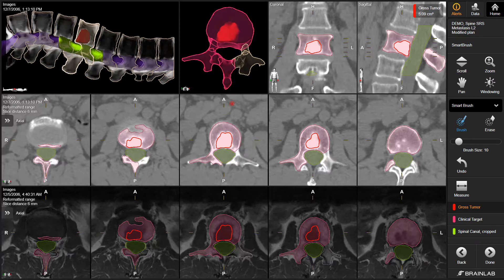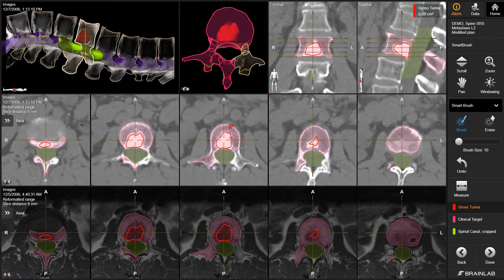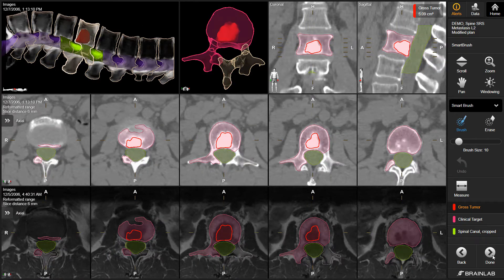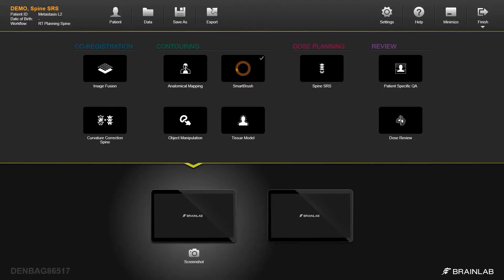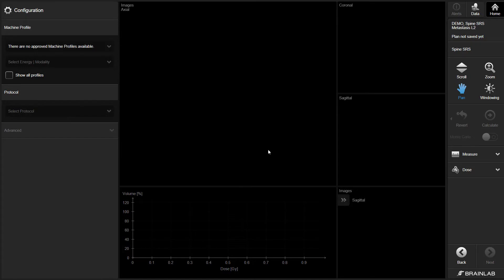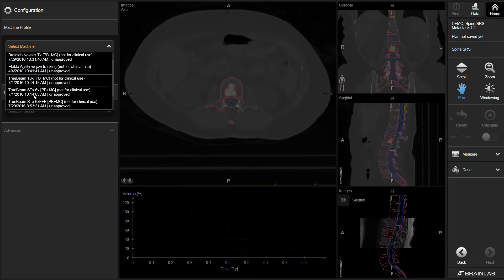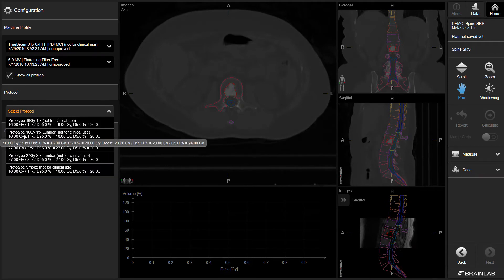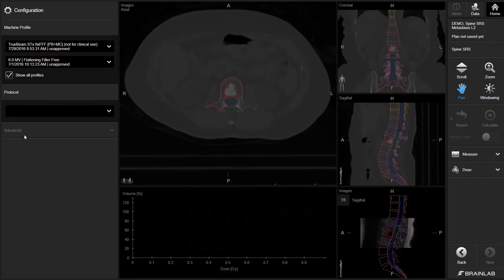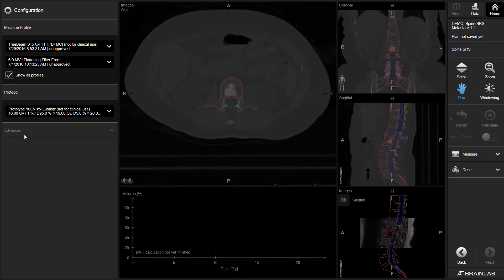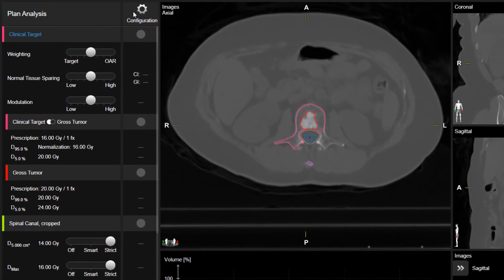Once the user is satisfied with the contouring result, pre-planning is complete and planning with Element Spine SRS can commence. Dose planning works with a high degree of automation to consistently and efficiently create high-quality treatment plans. All relevant organs at risk are detected using a standardized yet customizable protocol-based approach, with organ at risk objectives being intelligently placed and automatically prioritized.